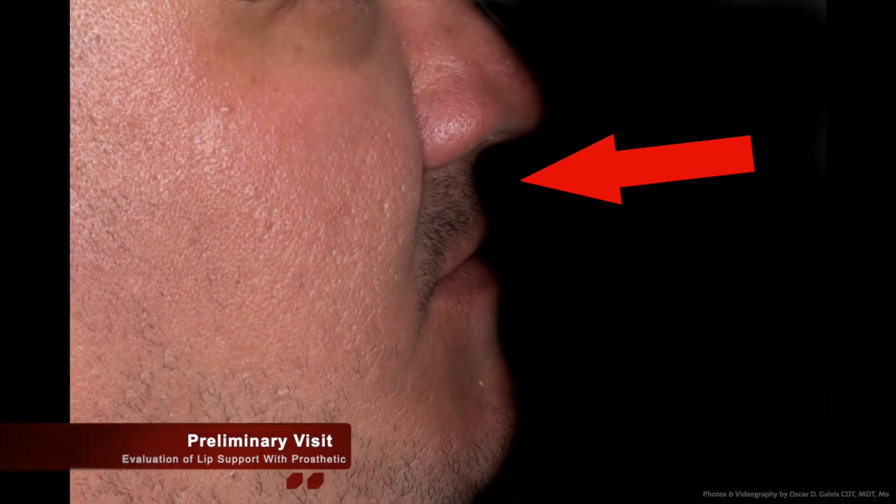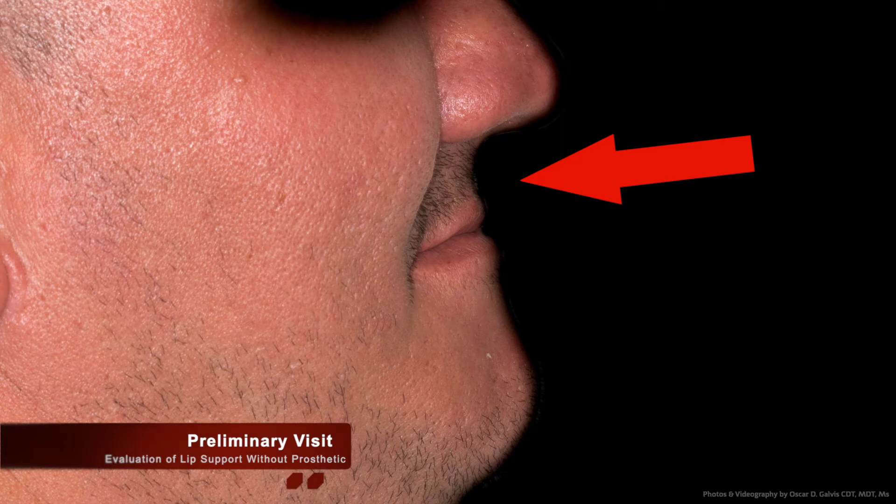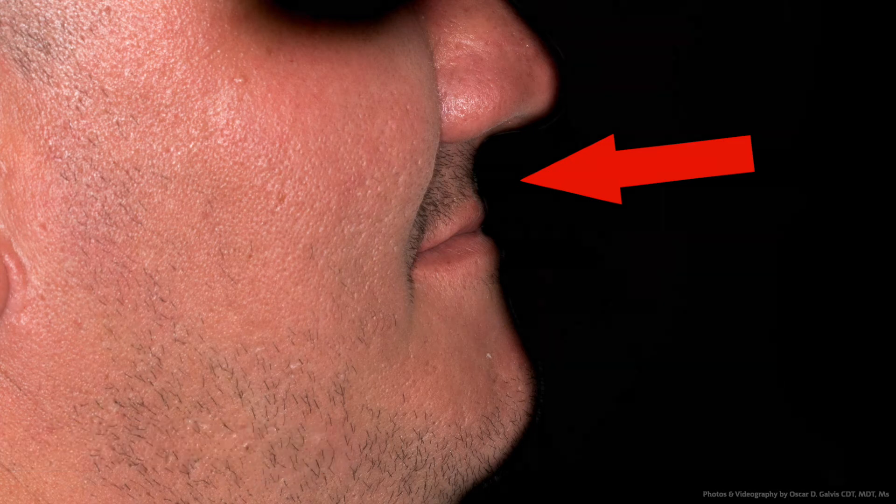During the initial evaluation, we will also evaluate the patient's aesthetic value while the dentures are in place and while they're not. We take a look at the lip support and how the lip is supported with the current denture, and if this is something we need to address while fabricating the new one.